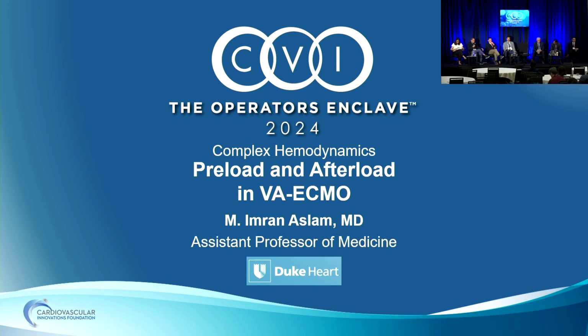Nico, last question. Yeah, so I was going to say pretty much something similar. We're running so often into this problem with these small ventricles after an MI. You cannot run the Impella more than P2, P3. It can interfere with the papillary muscle and can hemolyze. So my comment would be, find another venting way, keep the balloon pump in, maybe escalate to ECMO, instead of going progressively. That was kind of an alternative approach.